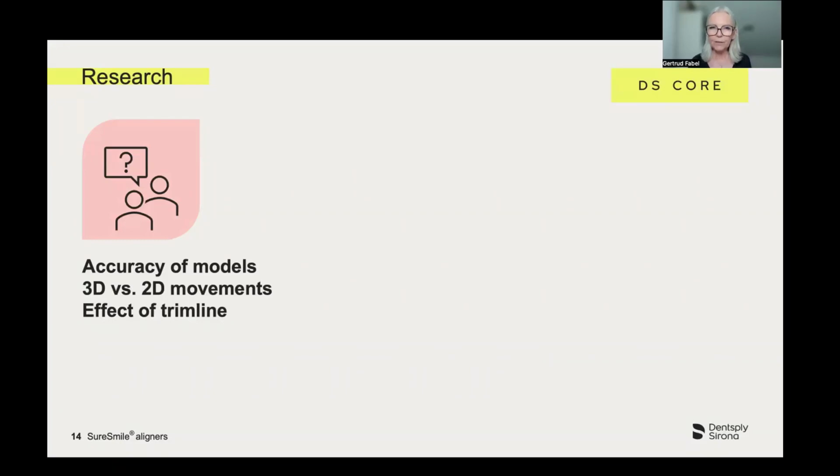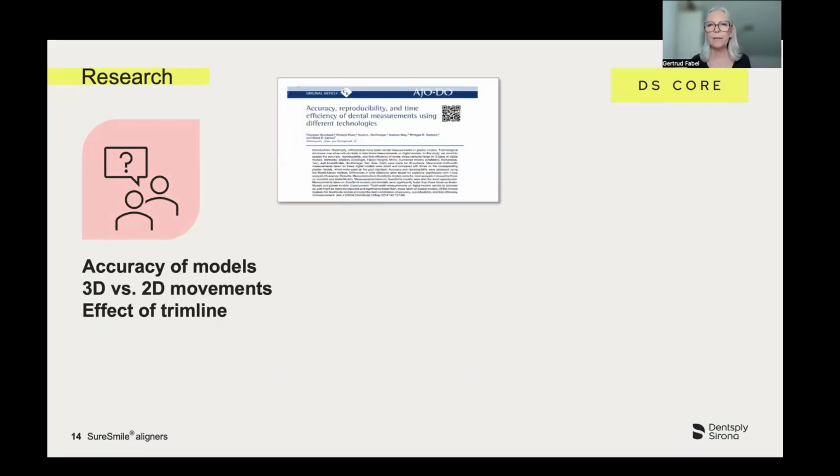And coming back to research, you find some studies which explain the accuracy and reproducibility of the models. So this is, in my view, very important. I mean, it's nice to have a perfect scanner, but it's a must-have to get perfect and exact models for the production of the aligners.